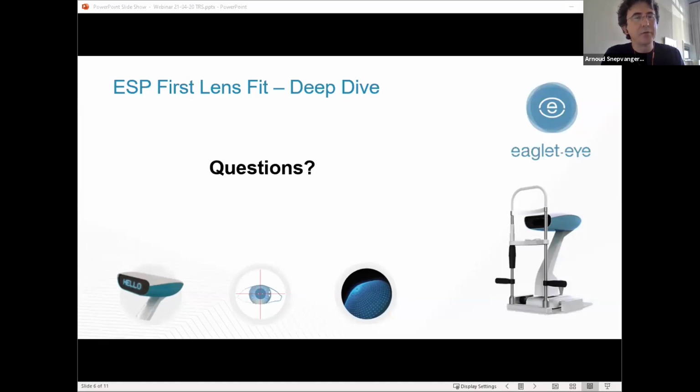If you were to turn to something really thick and gooey like a Celluvisc, for example, there you might expect some results. But of course, that is not for your average keratoconus cases. So there's been some research done on that, and they've found no effect.